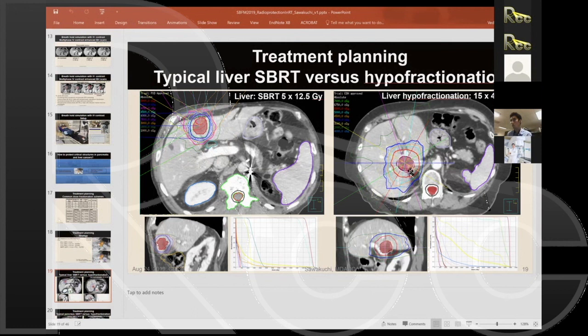Now, you can actually decrease the number of MUs per scan that you take for the breath hold, but the more samples that you have, the better. That has to do a little bit with a question that I was going to ask, but I actually didn't.